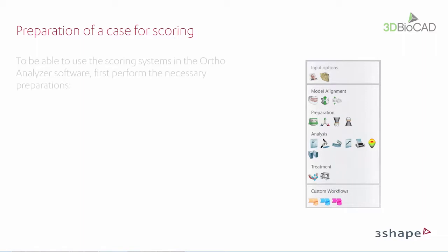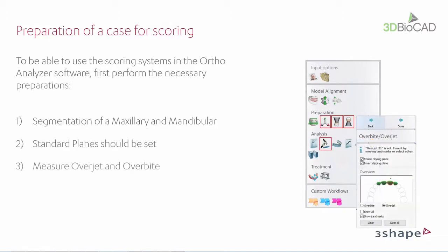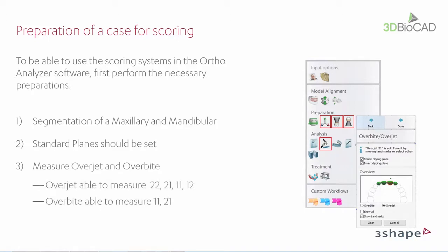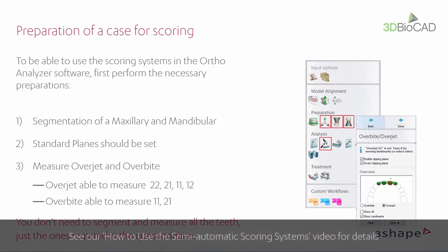You also have to remember to prepare the case for PAR scoring. Perform segmentation of maxillary and mandibular. Set the standard planes. Overjet and overbite should be set for the four anterior teeth and the two incisors, respectively. Please see our Scoring System Introduction video for more details.